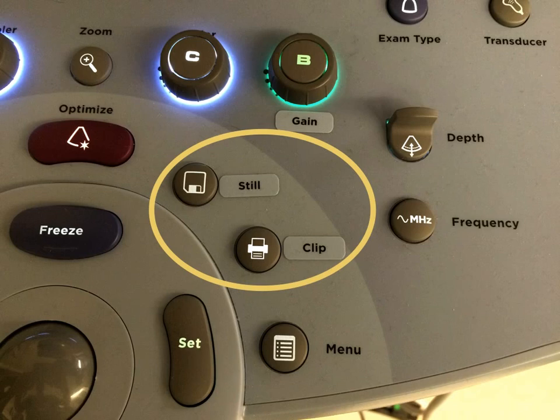This doesn't always work so well, especially when imaging small structures, when there is a lot of movement, or when you will have to make measurements of a structure. The second option is to tap the Freeze button, which will freeze the screen. You can then use the trackball to look back on what the machine has just imaged, stop at the one you want, and then tap the Still button to save that image. After every image is saved, there will be an audible beep.